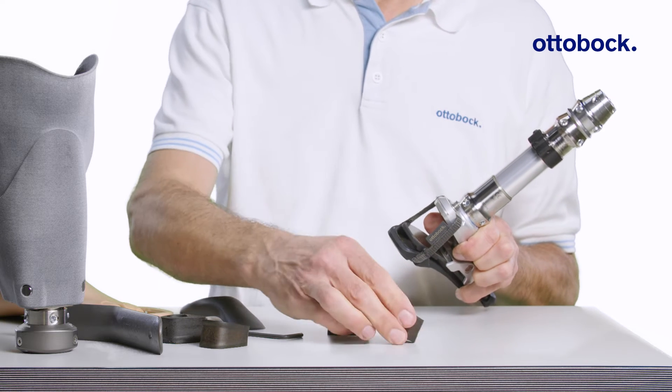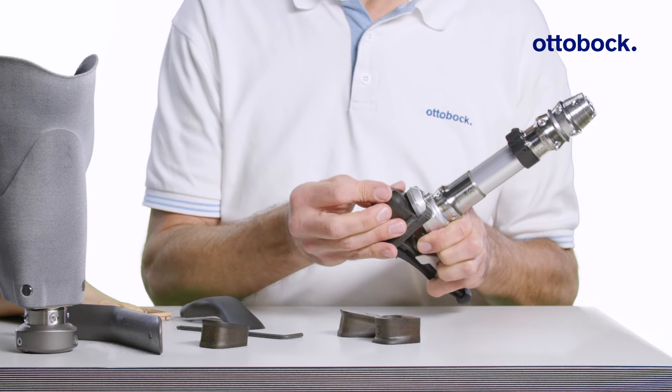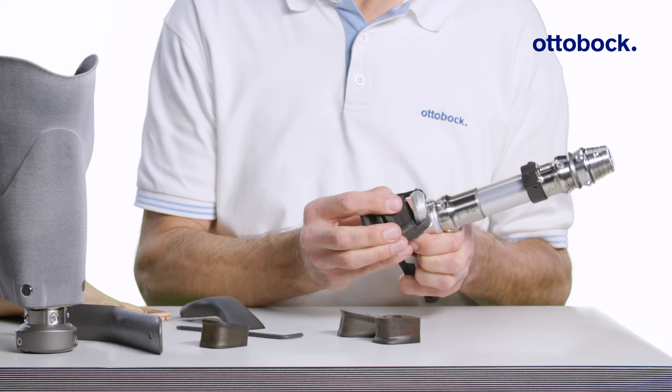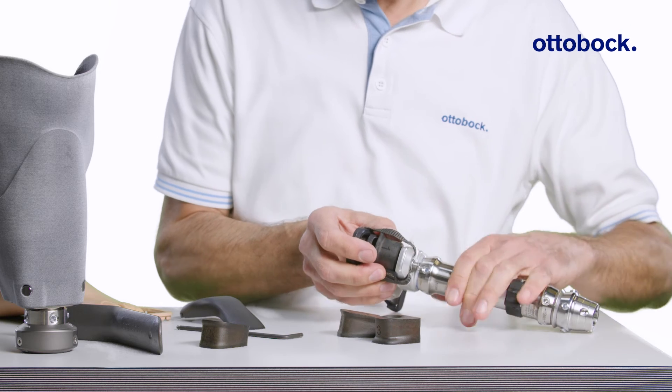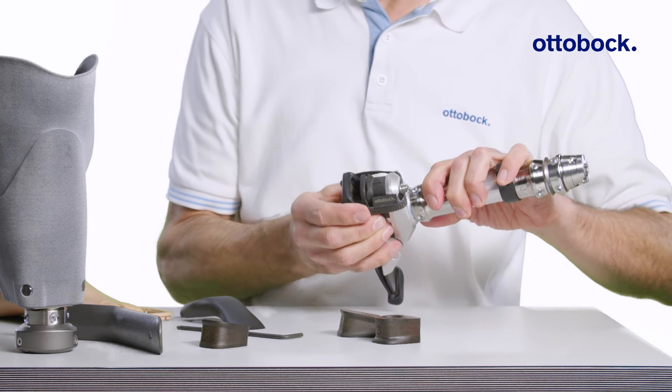Make sure to note the proper orientation of the wedge when reinstalling. Also check that the tension band retainer clip is properly seated on the inside of the foot before installing the wedges.